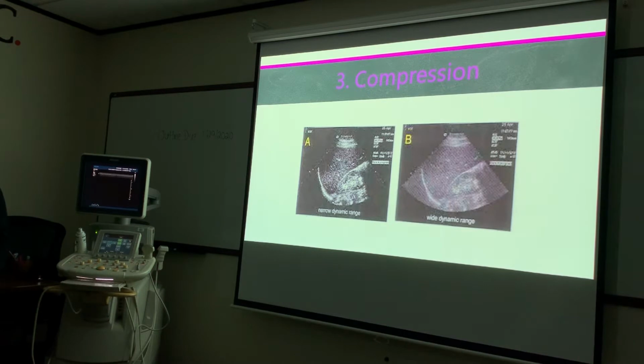But it works similarly, where it's going to make your... look at my brightness right here. Now look at it, it's super bright, right? Okay, and look at everything that's dark. It was gray, but now it's going to make it very dark. Meaning our range of colors that is displaying is going to be narrow.